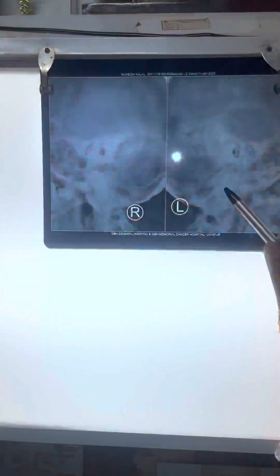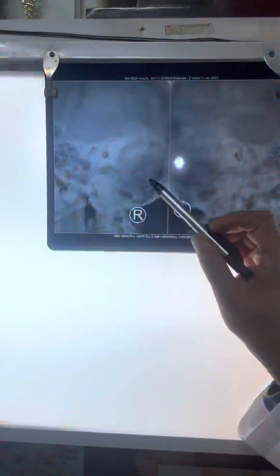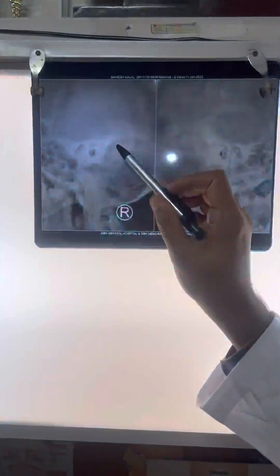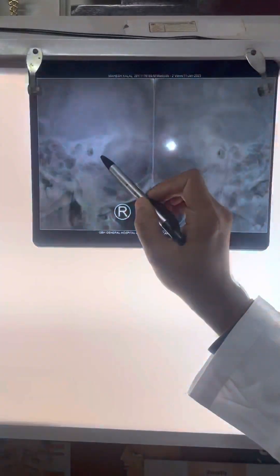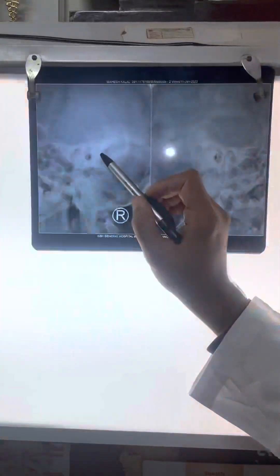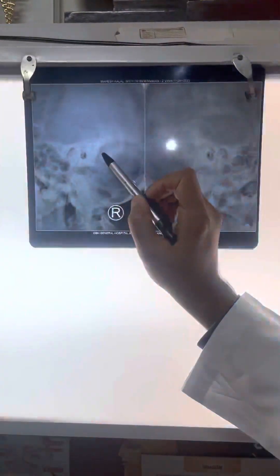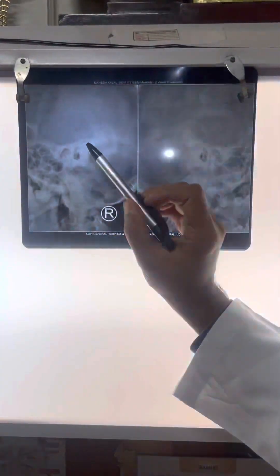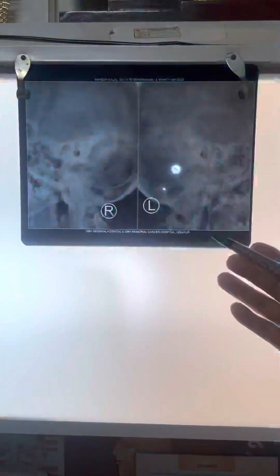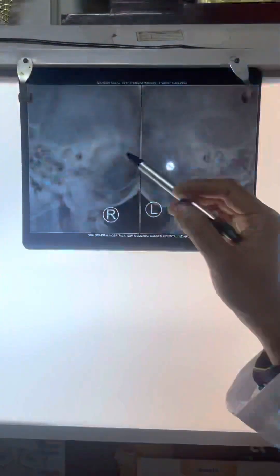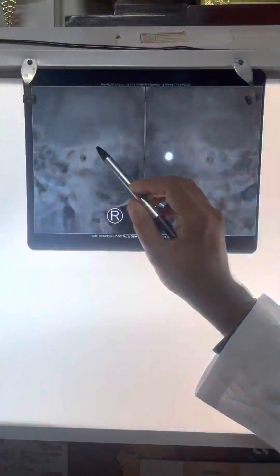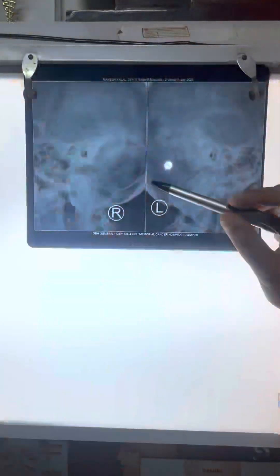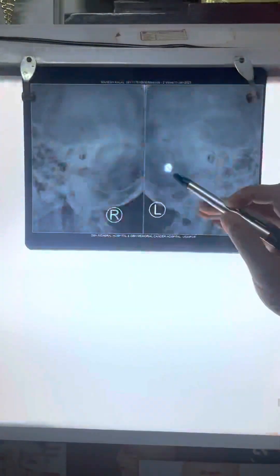The importance of doing an X-ray is: number one, it gives us an idea of the extent of the disease. Most importantly, it also shows the level of the dural plate and the sinus plate. If planning mastoidectomy, the surgeon is better prepared about how high or how posteriorly to drill in the mastoid region before expecting a bleed or breach in the dura. It also gives a good idea about mucosal pathology and the status of middle ear mucosa and disease extending into mastoid air cells. However, medico-legally it is not a very important tool — in cases of atticoantral disease we rely more on CT scans of the temporal bone.